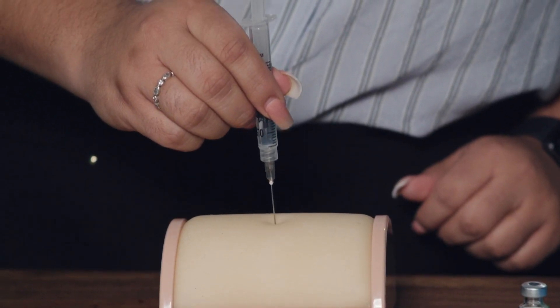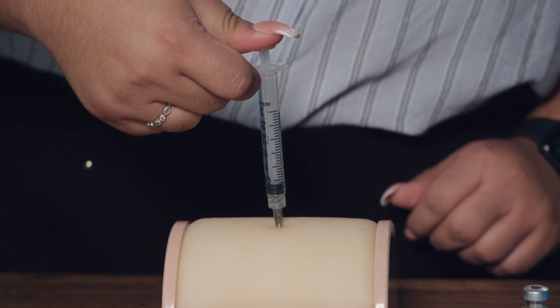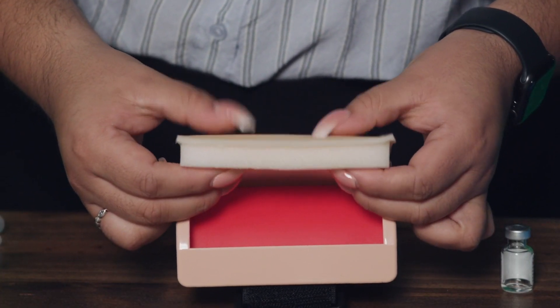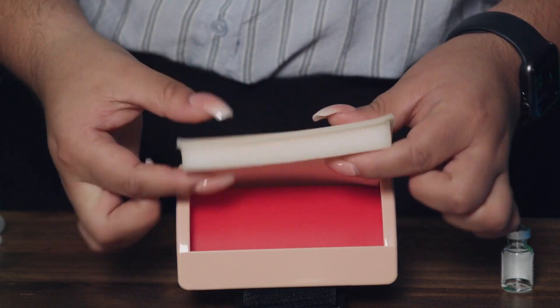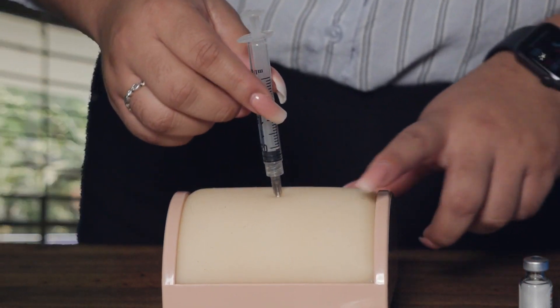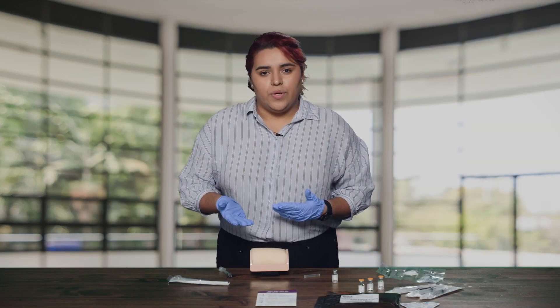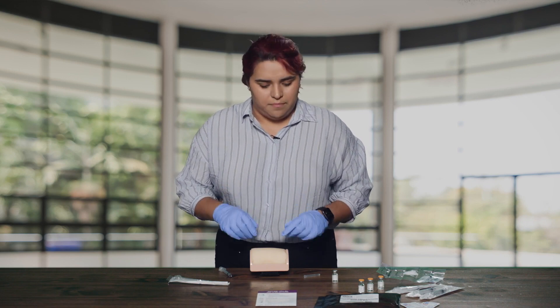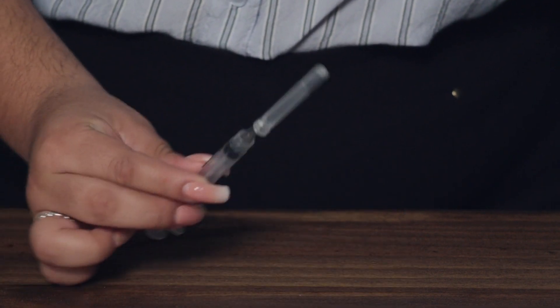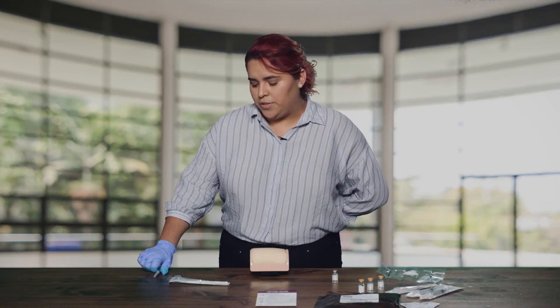Firmly insert the needle into the target area, keeping the syringe at a 90-degree angle to the injection site — do this in one solid motion. Try to make sure you are getting past the outer skin and into the fat layer and then into the muscle. Push down on the plunger to inject all the medication into the muscle, then pull the needle straight out. Being very careful not to poke yourself with the used needle, put the needle back into the safety cap. Some people find it helpful to put one arm behind their back while recapping to avoid using their other hand. Click it into place to seal it shut and set aside for when the first responders arrive.